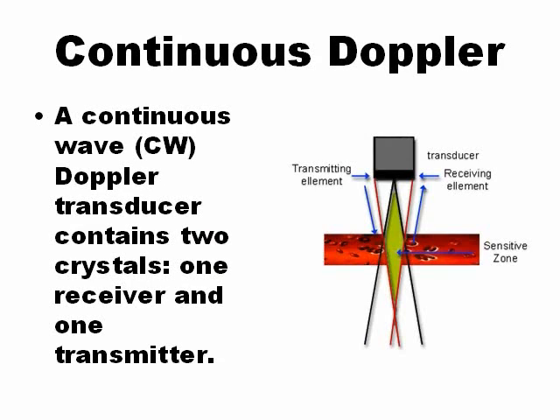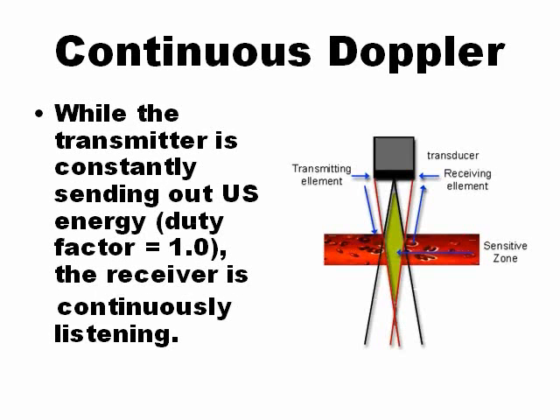Continuous Doppler is very different. The theory of continuous Doppler is different. Continuous Doppler does not produce pulses. Continuous Doppler has two crystals. One crystal produces ultrasound, the other crystal receives the ultrasound. One transmitter, one receiver. This is why the duty factor in continuous Doppler is equal to 1, because the machine spends the same time transmitting as receiving.